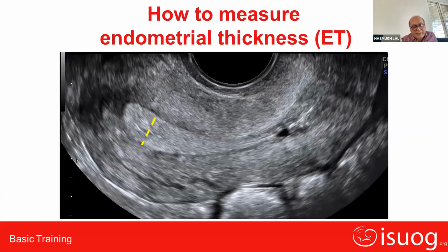So how to measure endometrial thickness? Very, very important, because in each and every patient of gynec pathology, we have to do TVS and we have to measure the endometrium. Let's show that.